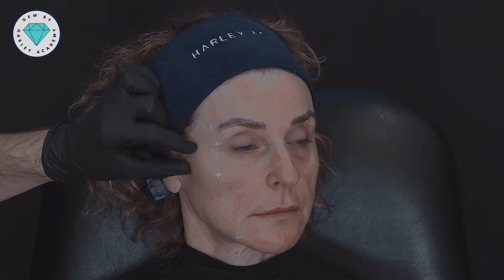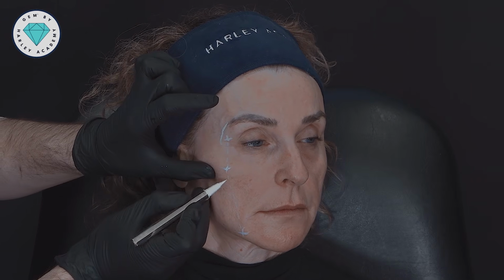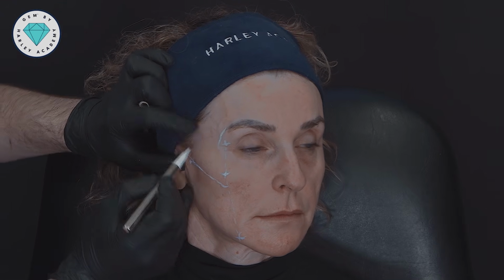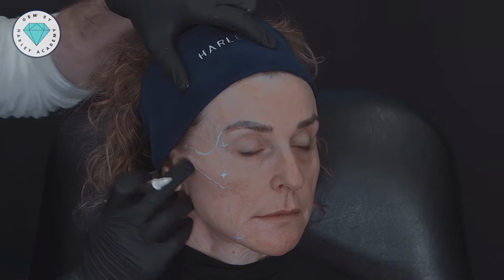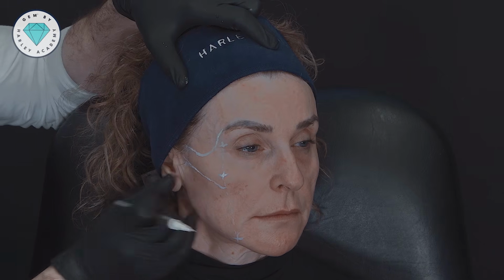So my treatment plan today is going to start with the lateral midface. And first of all, I'm always going to want to identify the boundaries of the zygomatic arch. And we can follow the cheekbone like this. Kind of goes like this. Once I'm happy I've found the zygomatic arch, I know the natural direction the cheekbone is going, and so I have the angle of my cheekbone. So that's really important.